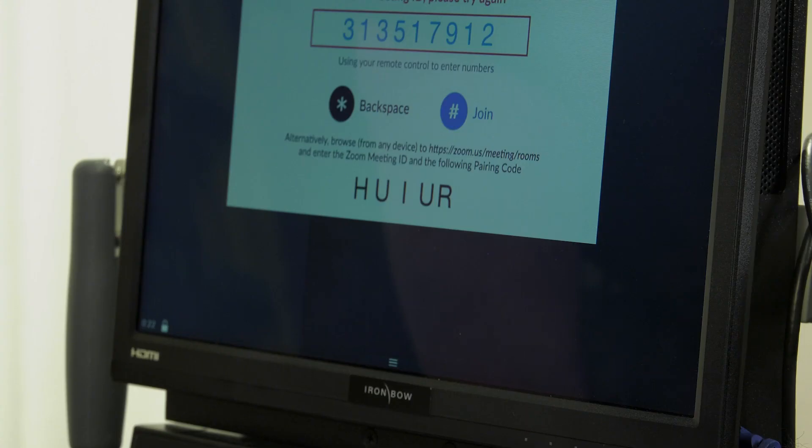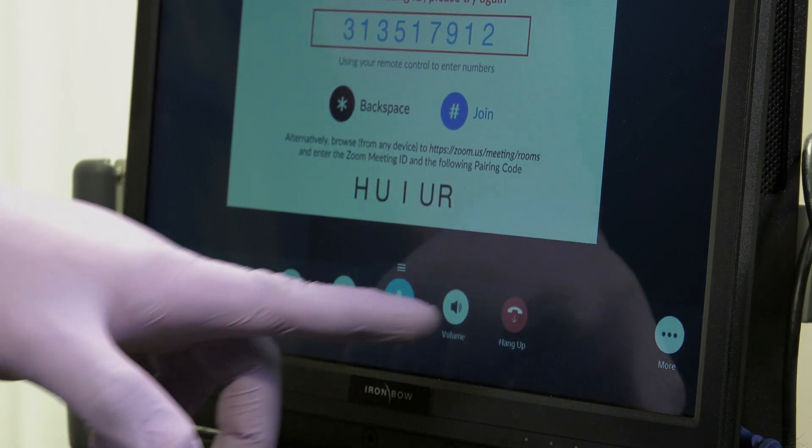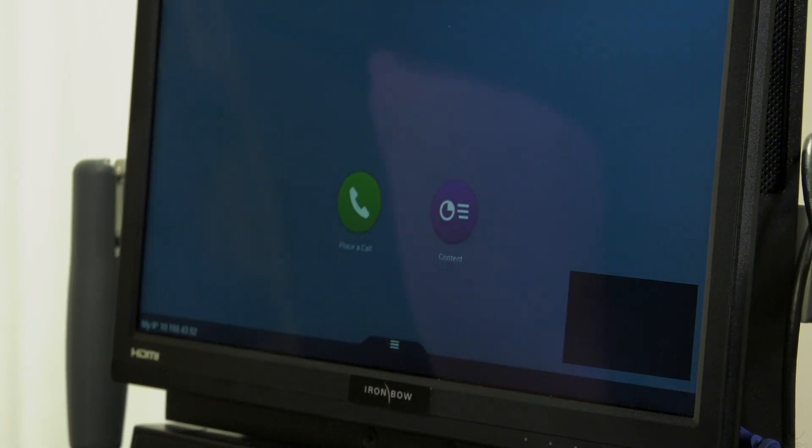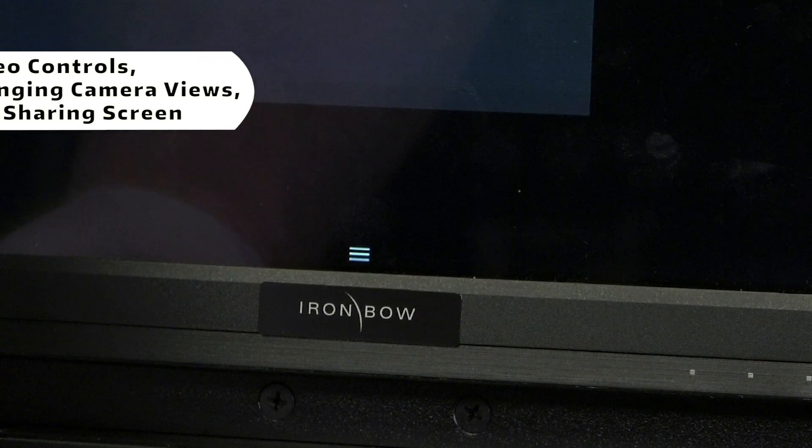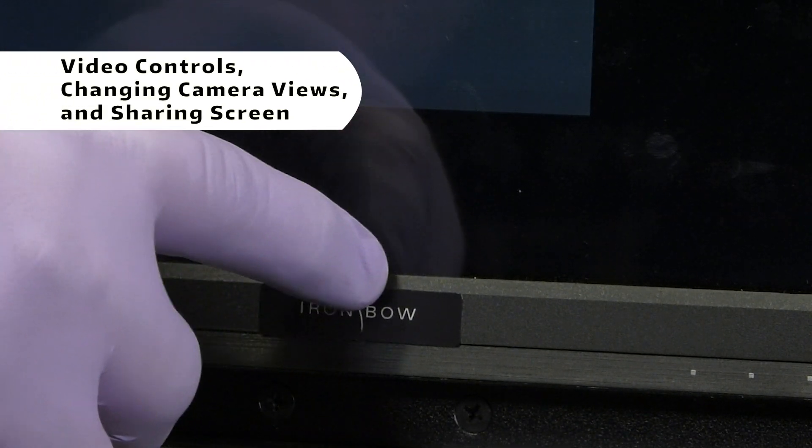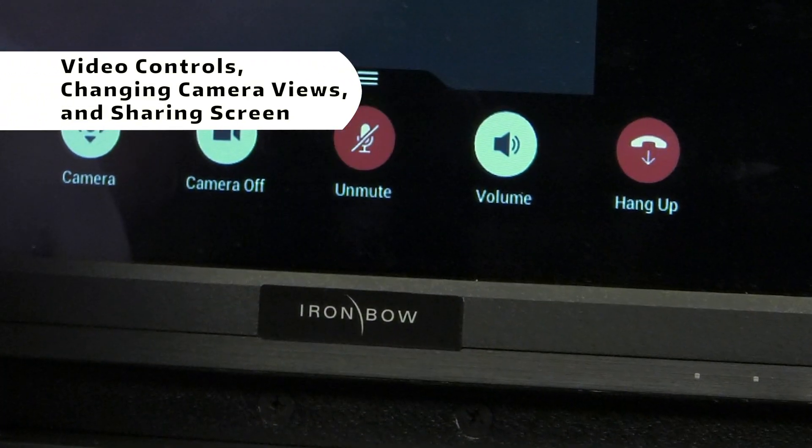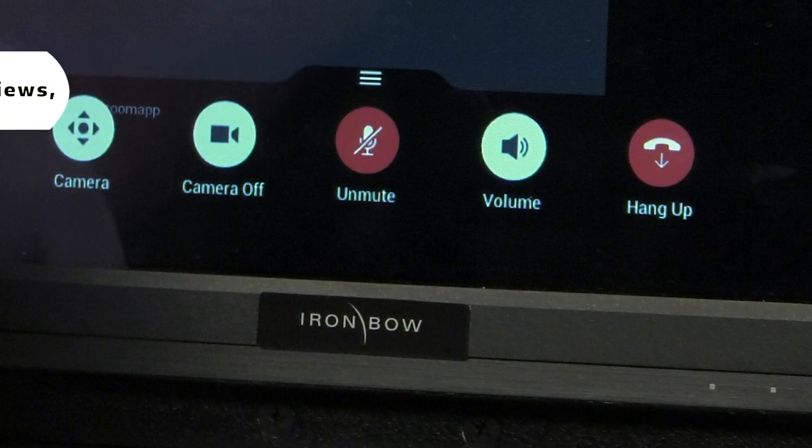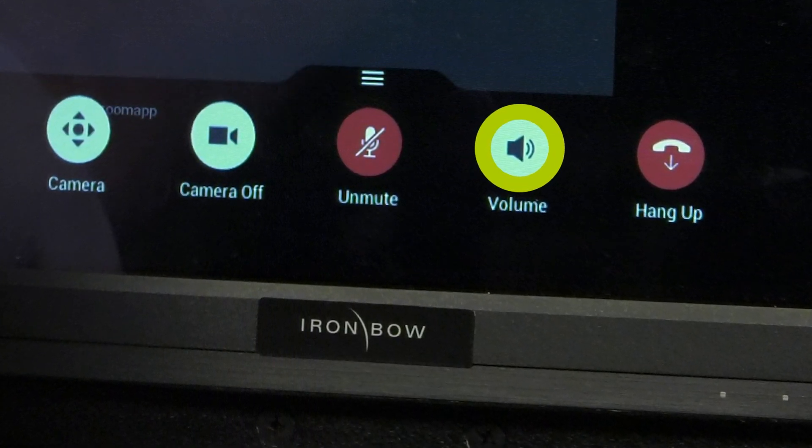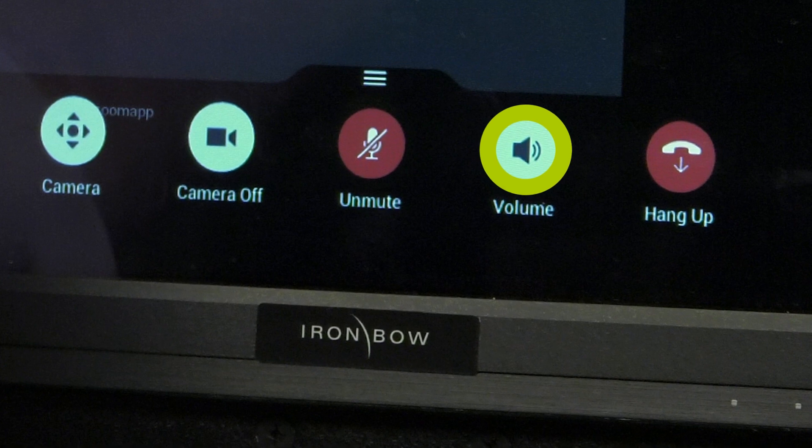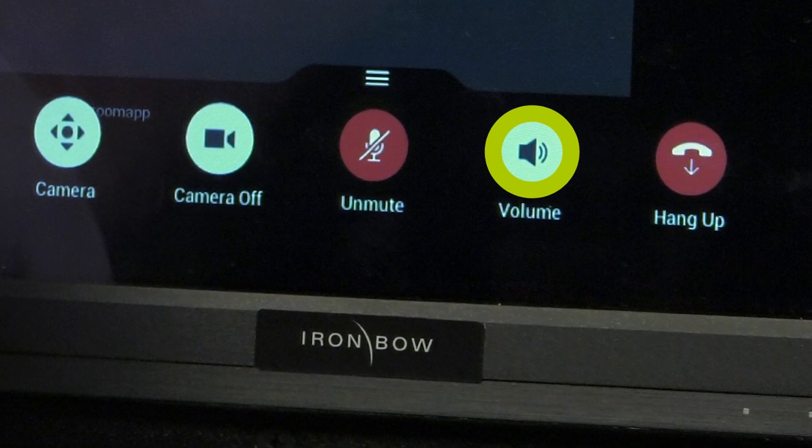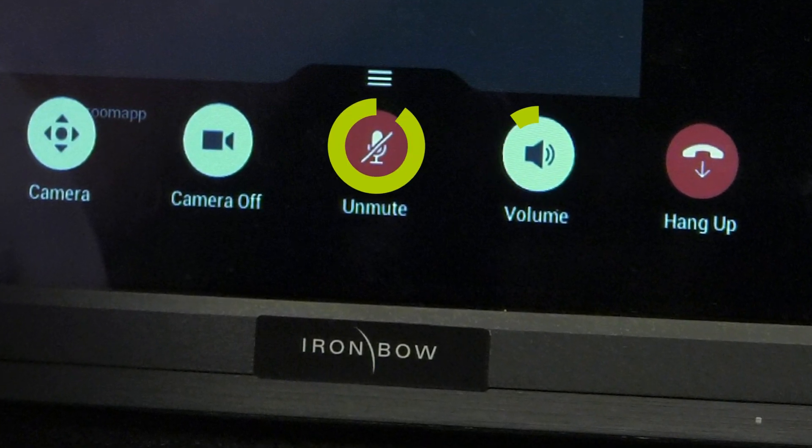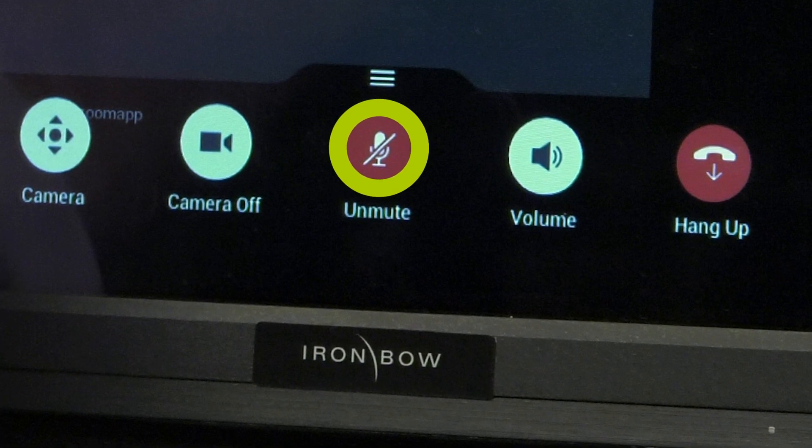When the Zoom conference is finished, tap the hang-up button on the on-screen interface to end the call. During a Zoom call, you can tap the on-screen menu to bring up video controls. In this section of the menu, you can adjust the audio volumes of the meeting, including the overall sound of the meeting and microphone volume. You also have the option to mute and unmute your microphone.